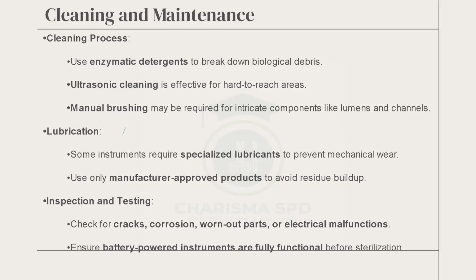These are all surgical instruments that use electrical energy, and they are all treated differently. For these 5 instruments I have just mentioned, that is what I use in my facility. They each have their own lubricants. They don't use the same one. So you have to use the appropriate lubricant for the exact piece that you are working with. So when you get to the department, learn, it will help you.